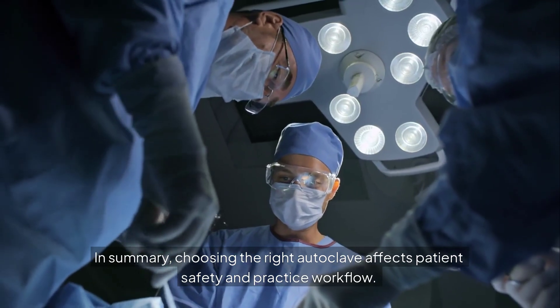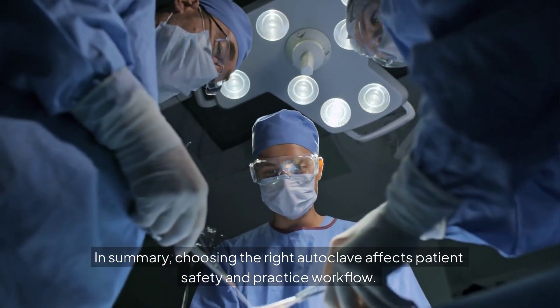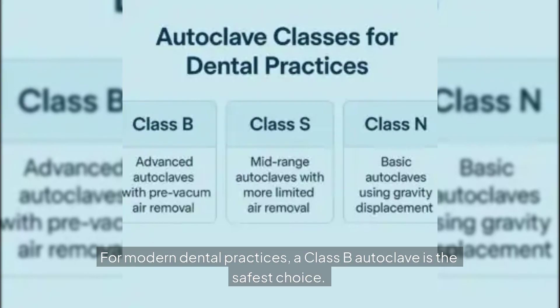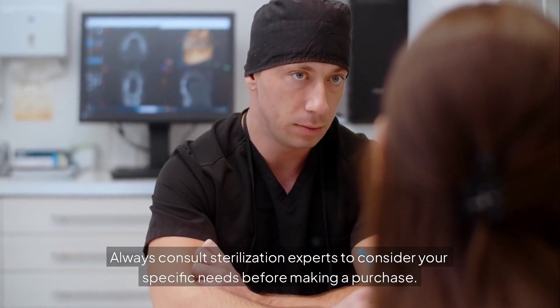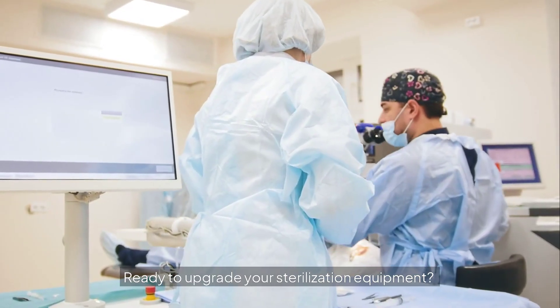In summary, choosing the right autoclave affects patient safety and practice workflow. For modern dental practices, a Class B autoclave is the safest choice. Always consult sterilization experts to consider your specific needs before making a purchase. Ready to upgrade your sterilization equipment? Get a quote today.